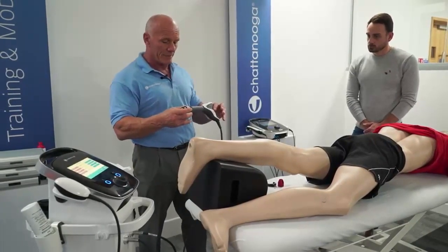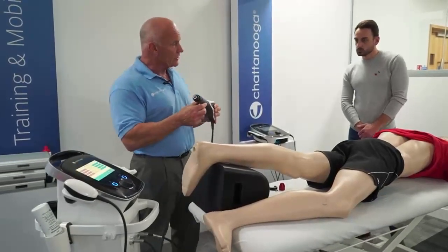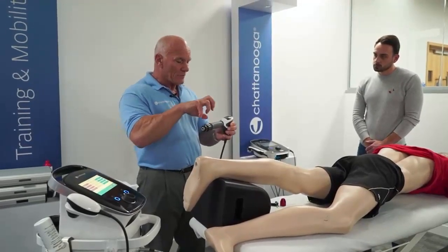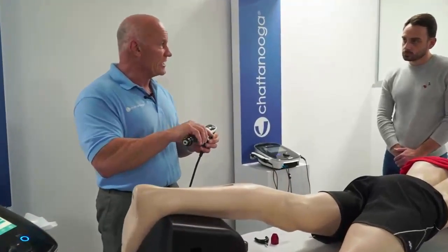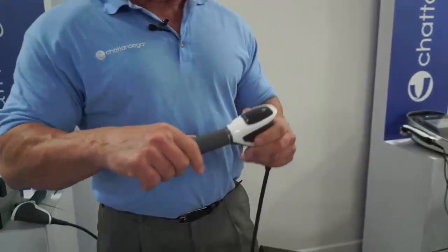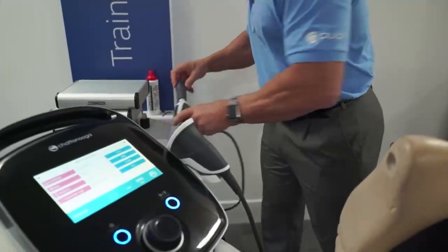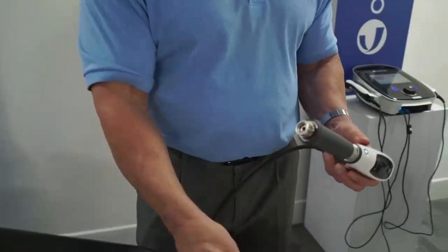What you have to do is, after 1 million shocks, change the barrel and the projectile. And that's very, very simple to do. In fact, if I show you on this handpiece here, look, I take off the transmitter.